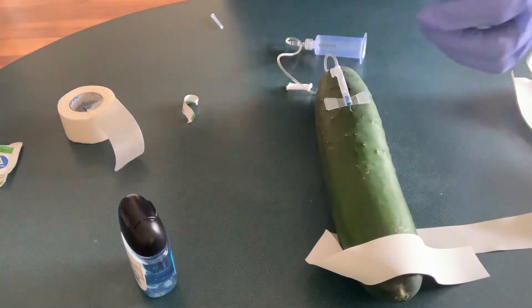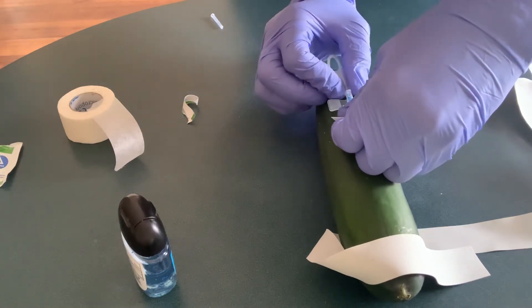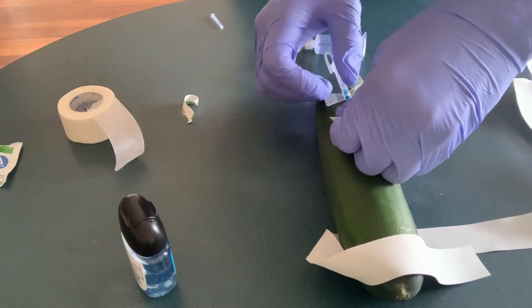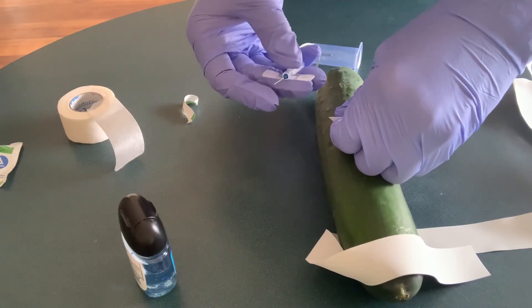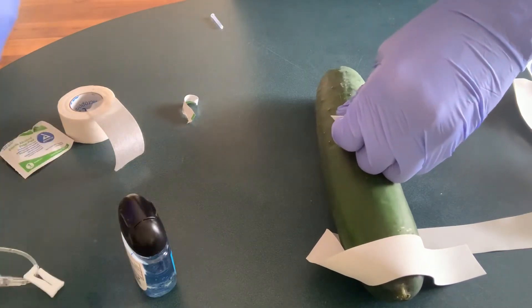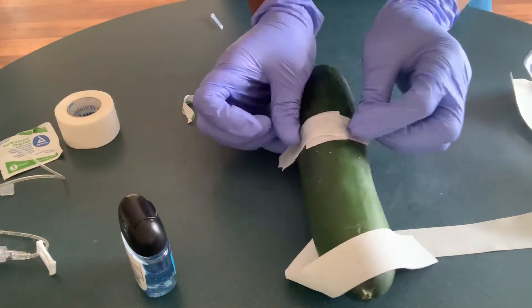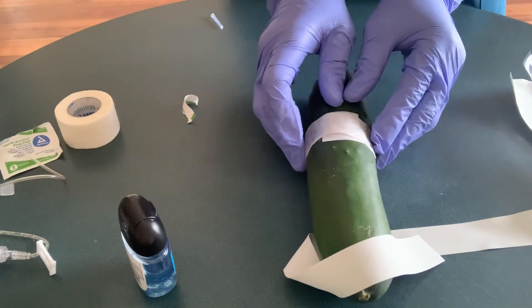I'll use my cotton wool or gauze to hold the site, then pull out my needle. Normally I'm supposed to press this little knob here so that I can retract the needle, but I don't want to retract it and discard it because I still want to use it for the demo. Then I'm going to use my tape to hold it, making sure it's secured tightly to reduce blood flow.